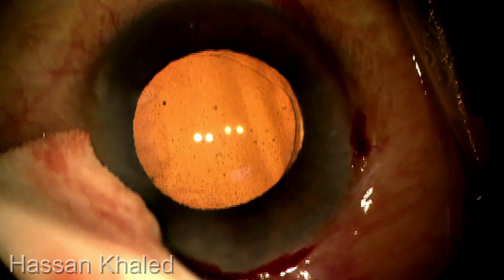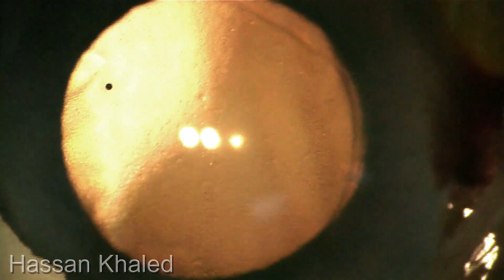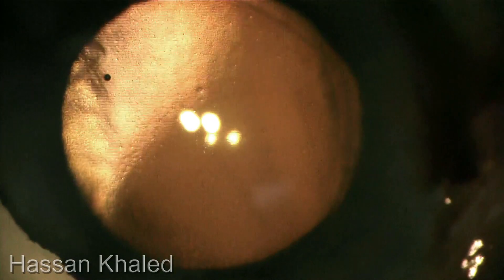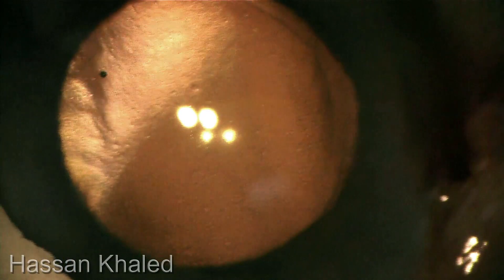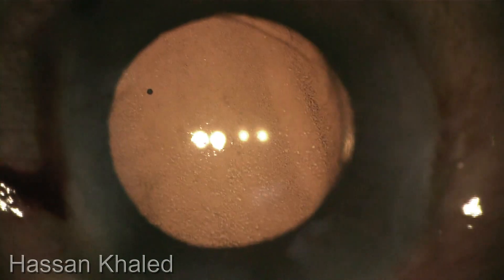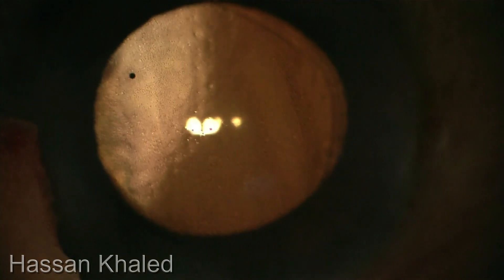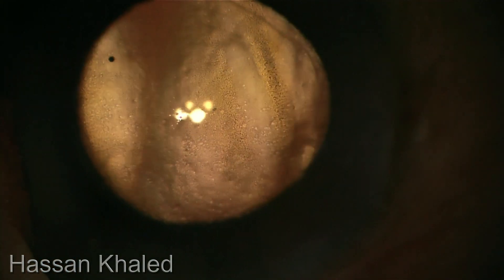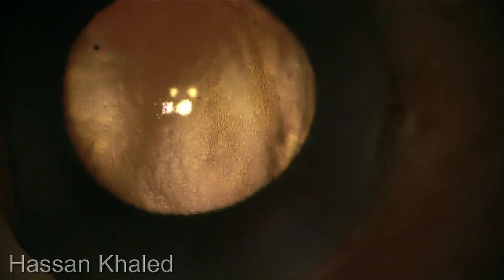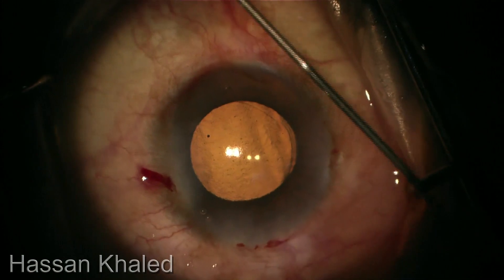Here I'm also showing you the gutata through the red reflex. You can see the pitting on the posterior surface of the cornea through the red reflex — it is very clear with high magnification under the microscope. You can see these white dots, and it is like pitting on the posterior back of the cornea.